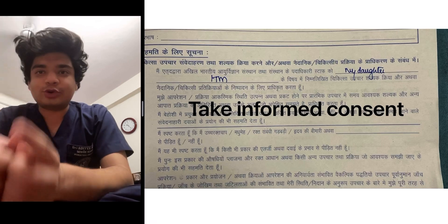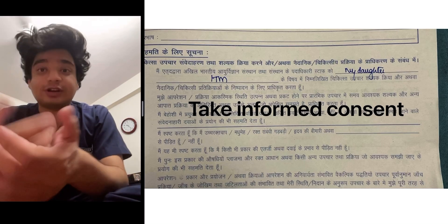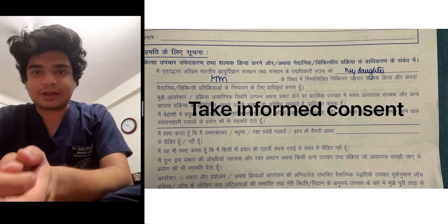In this video, we will learn how to do a lumbar puncture and at the same time inject drugs intrathecally. This time we will be giving intrathecal methotrexate for the treatment of B-cell acute lymphoblastic leukemia.